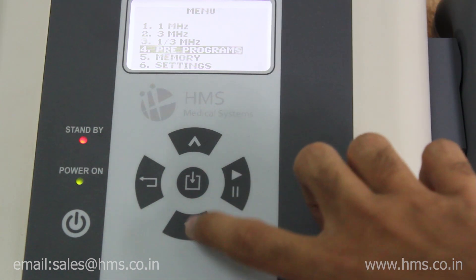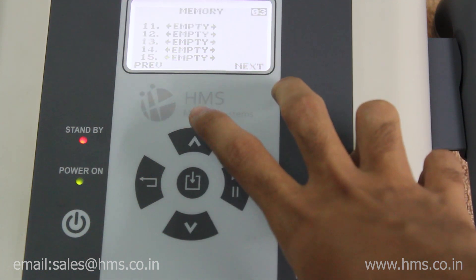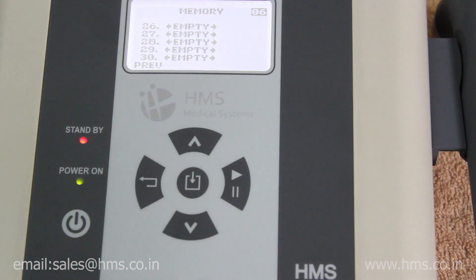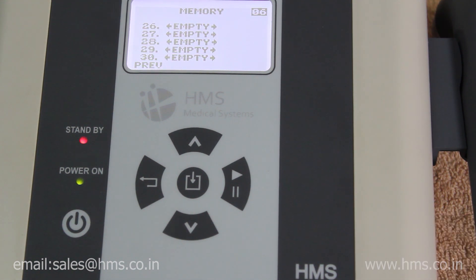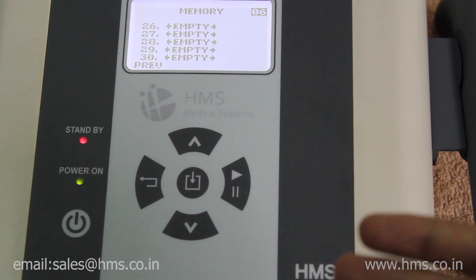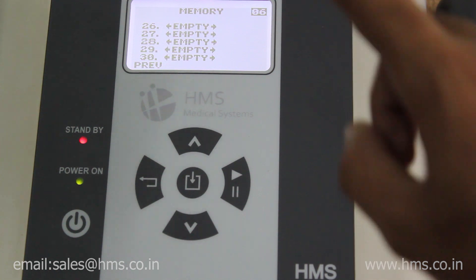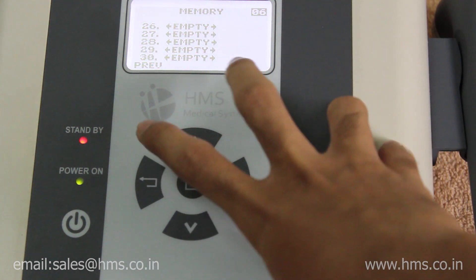Next is the memory settings feature. You can save up to a maximum of 30 memory settings according to your needs. These memory settings can also be erased and rewritten, which is a unique feature offered with the Digisonic 3S.